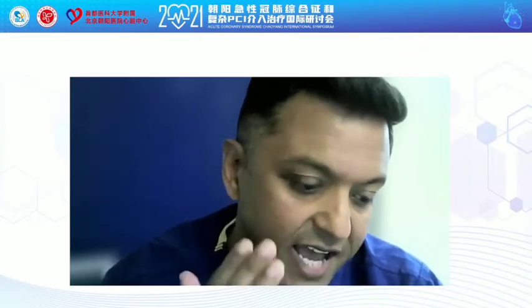So things like having a large bore guide catheter, having a guide extension system, using microcatheters from the outset. I wouldn't just start with a guide catheter and a wire and then step up slowly step by step. I often start with quite a lot of initial equipment to maximize my chances to get through. Once it comes to crossing the lesion and understanding how it's behaving with balloons and equipment like that, I then decide, okay, do I need to now go ahead and step up to the atherectomy stage?